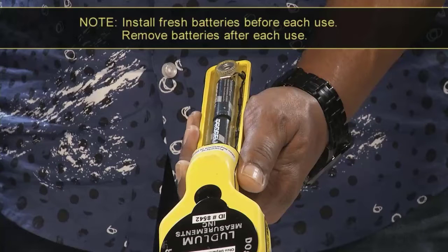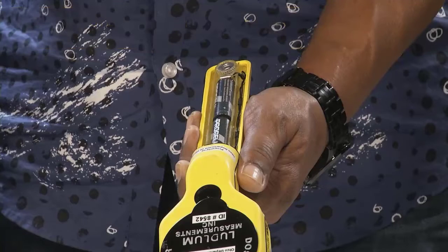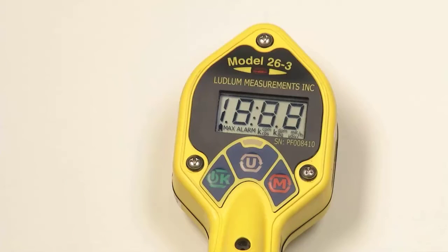Batteries should be removed after each use to prevent corrosion of internal electronic components. Battery life is approximately 500 hours. A low battery indicator on the LCD warns when less than 16 hours of battery life remain. If the low battery indicator is on, replace the AA batteries.